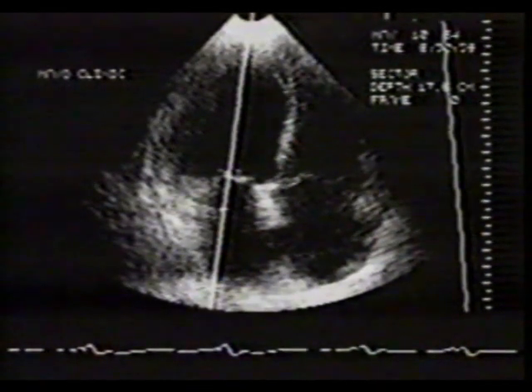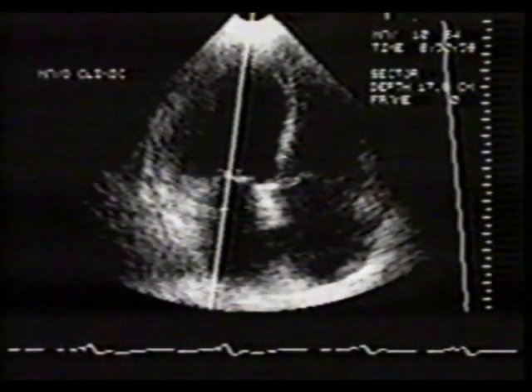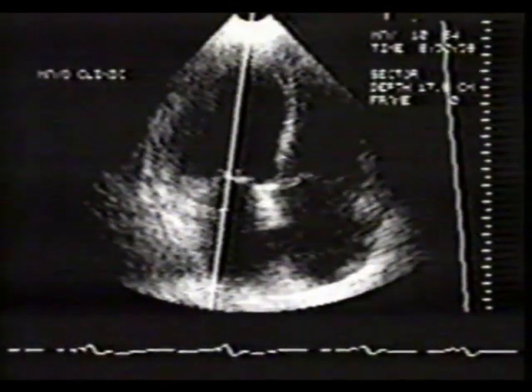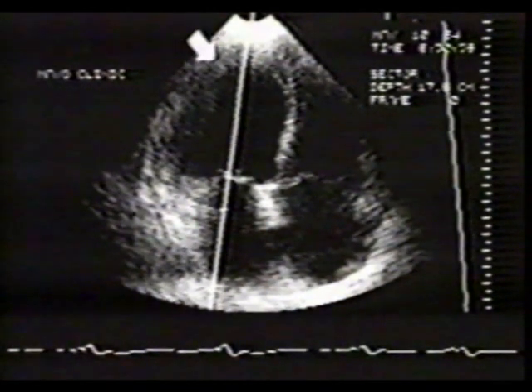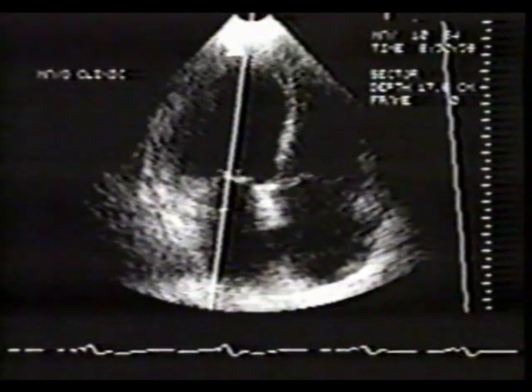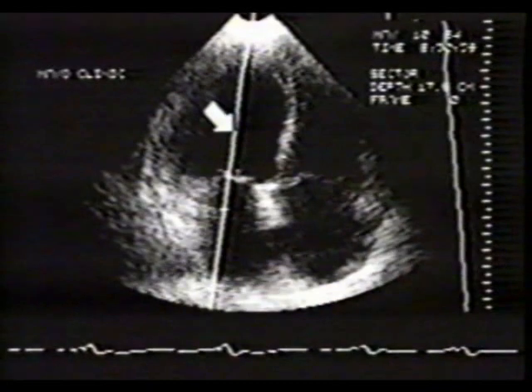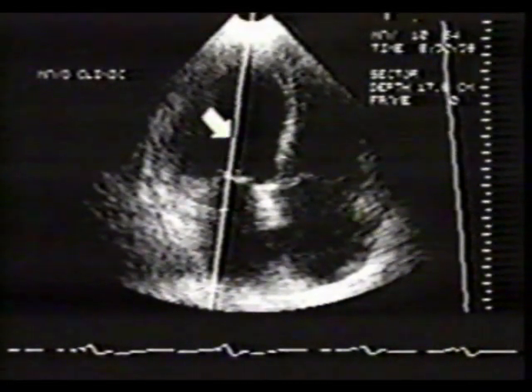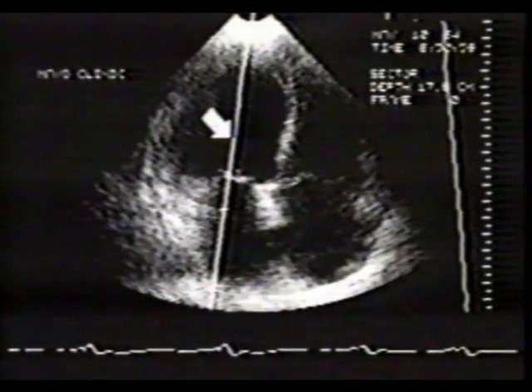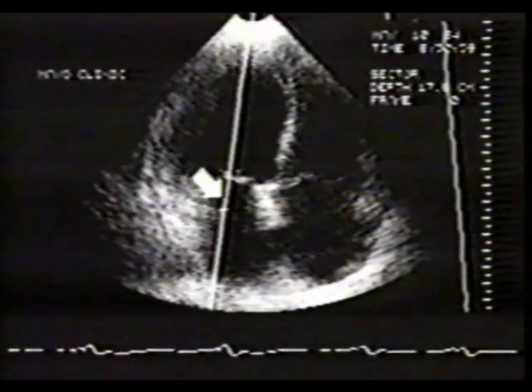The Doppler examination can be guided by 2D imaging. The region of interest is imaged in the standard fashion. In this case, an apical 4-chamber view has been obtained. A Doppler cursor is then directed across the image along the expected axis of flow. This is referred to as duplex imaging. Here the cursor has been directed across the mitral valve.